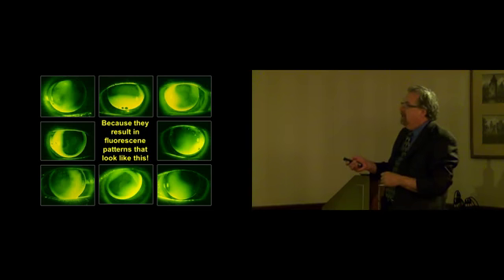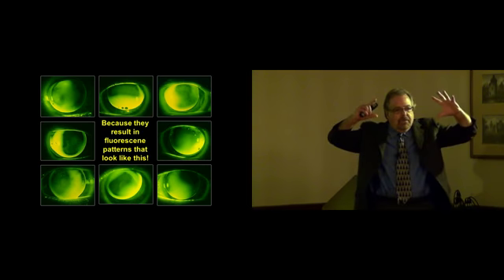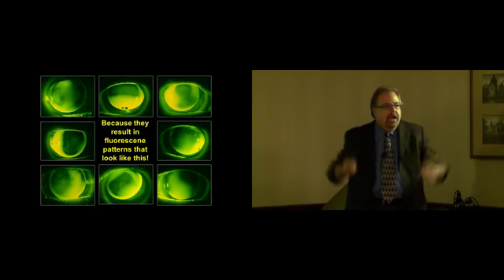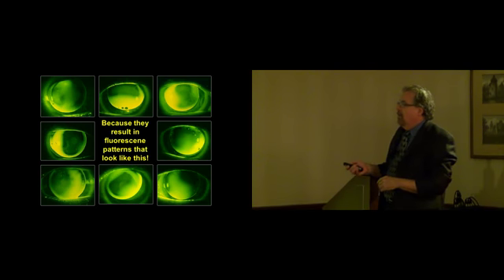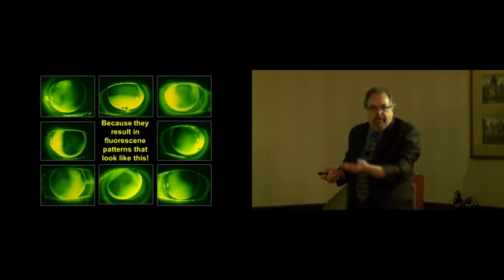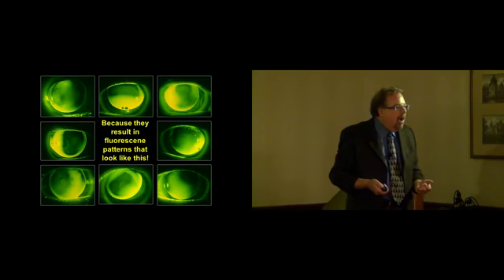When we put these corneal contact lenses on these eyes, what we end up with is areas where the cornea is the highest, because that is where the lens is going to first come in contact with the tissue, and then where the cornea is the steepest, has the greatest amount of curve, the lens is naturally going to lift off.